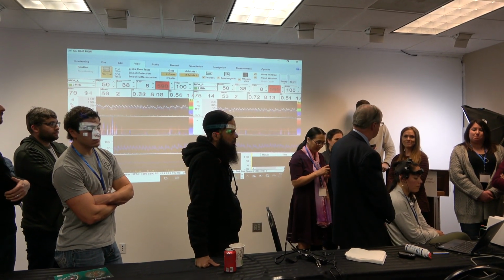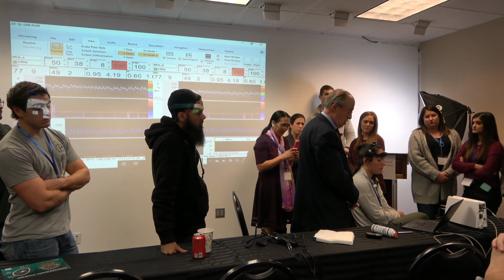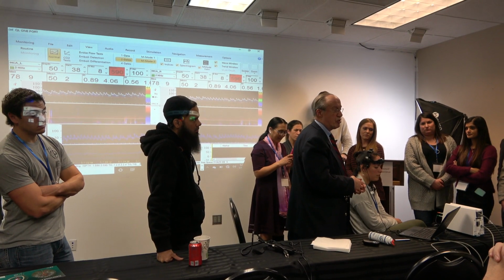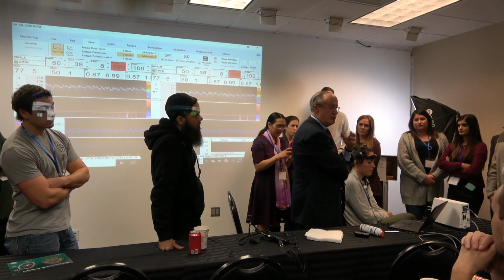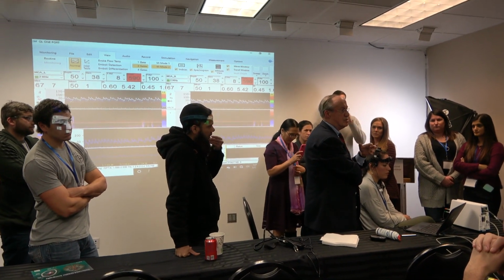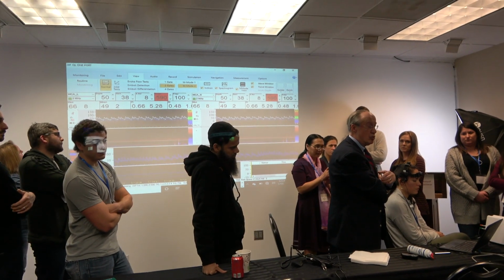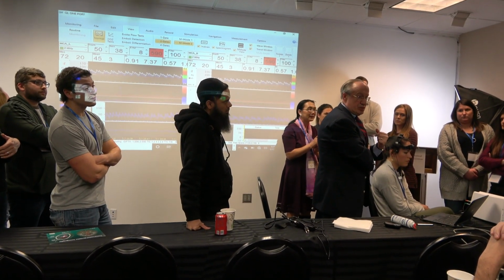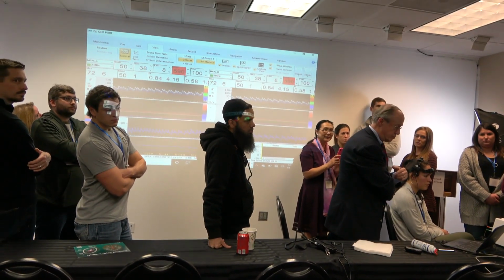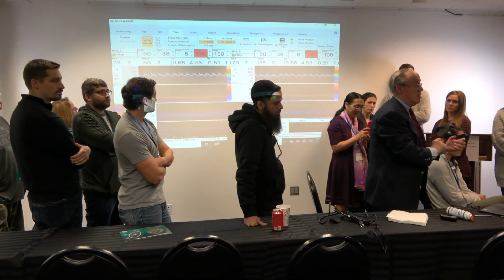Questions for me? And of course, when we talk about PFO, for example, I don't know if you're familiar with how cardiologists do it. They do injection of bubbles at rest, and then the so-called Valsalva maneuver. So you ask the patient, just bear down, all right? So the patient bears down, and we again inject bubbles.